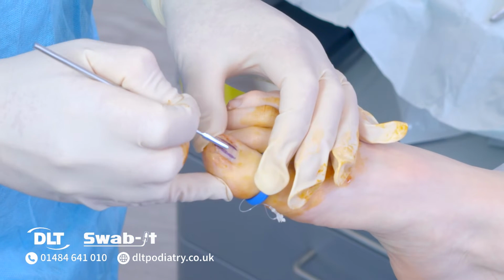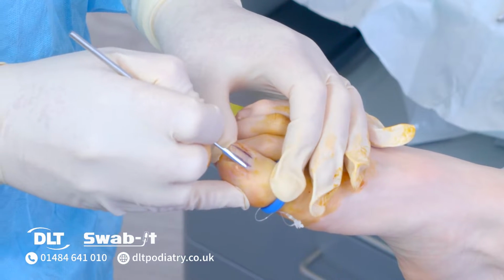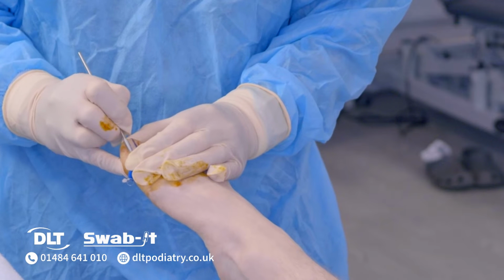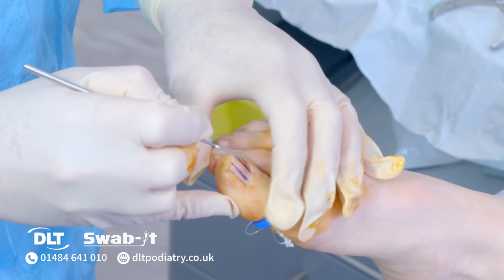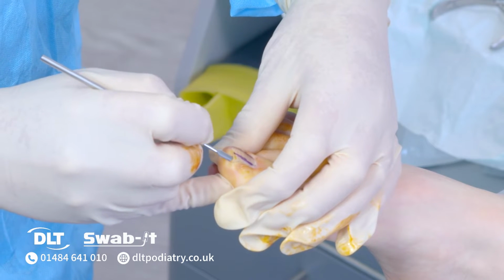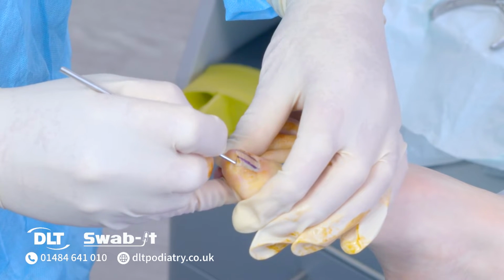So just for the purpose of training, we'll briefly talk through a wedge resection. The first stage is we separate at the eponychium, and then use an elevator gradually down the free edge of the nail at the hyponychium towards the eponychium.